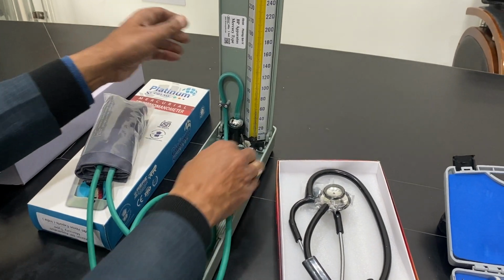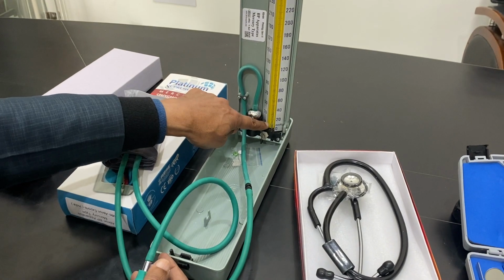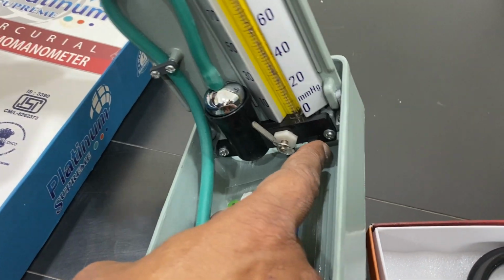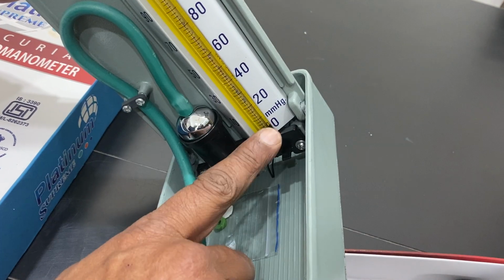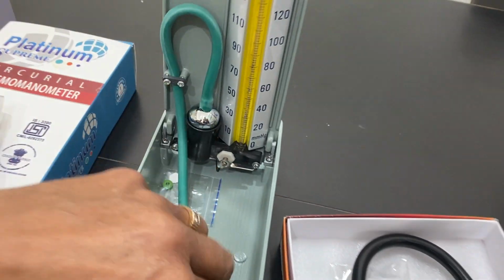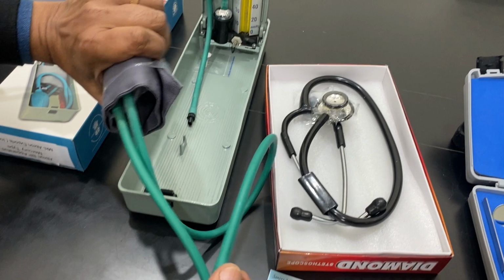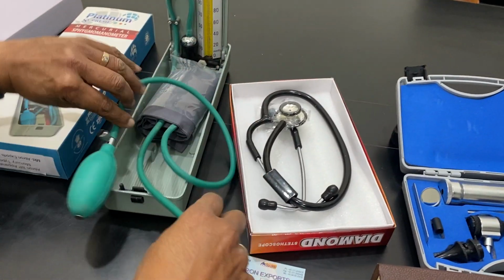When you have used it, its air should be cleaned out. Now see, mercury has gone down, but still some mercury is visible. So you have to turn it on one side and close it to the right side, close it, and then you can separate this and push it so that the air has gone. Open this, push it thoroughly so the air is not inside any of the balloon.